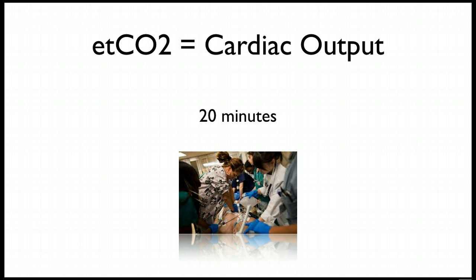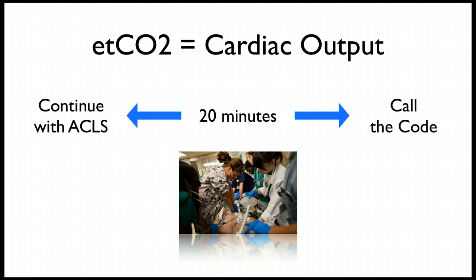So say you're doing CPR and you hit the 20-minute mark of ACLS and nothing has changed. The patient has been in PEA, in and out of another rhythm, the whole time with no pulse. Typically you think about calling the code. It just means you would weigh the scenario, maybe look at the patient, and decide yes or no whether you would call it or continue. So what if I told you that end-tidal CO2 can be another feather in your cap for deciding whether or not the patient really has any chance of getting return of spontaneous circulation with continuing?